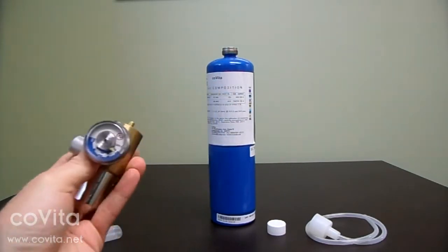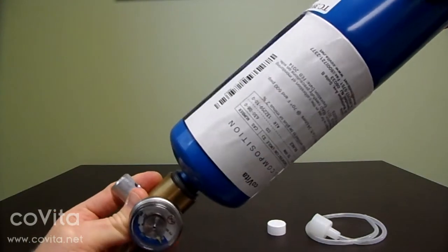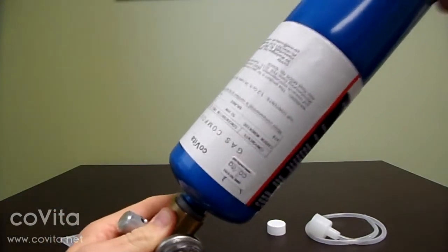This is easiest to do by holding the can in the palm of your right hand and the regulator in your left hand. Apply pressure, screwing the can into the regulator.